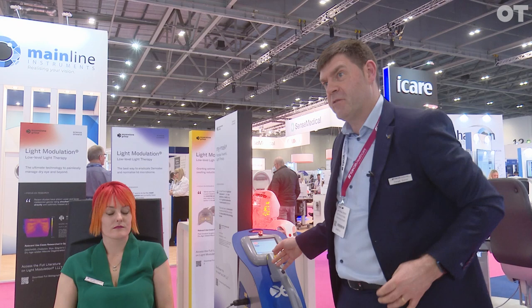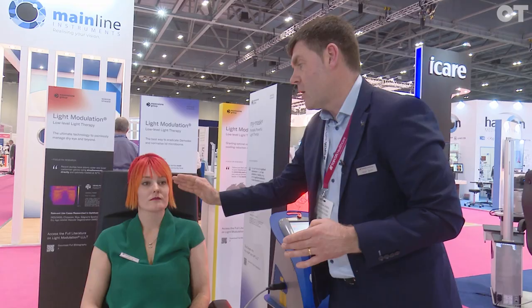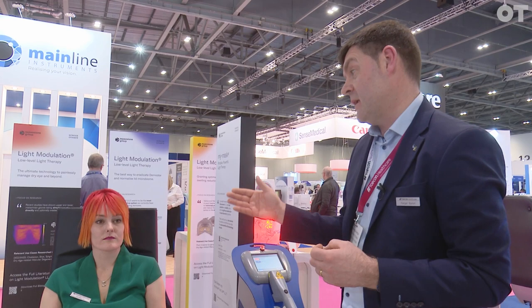So with this device, we're going to be treating dry eye today. It's a two-step process: we treat the patient first with an IPL treatment and then secondly with low-level light therapy. That's a fairly quick process where we're applying some thermal shots around the patient's lower lid, having an effect on the glands in the lower lid. You need to wear protective goggles, both the patient and the user. Treating the lower lids on its own is not enough — you really need to be treating the upper lid as well.